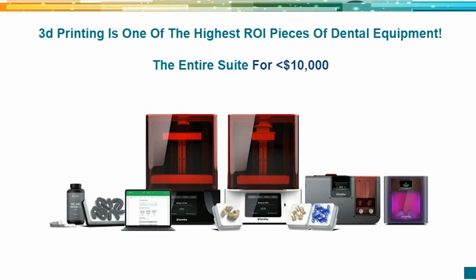So you're going to be looking mostly at that printer on the left, which is the black one, which is the Pro 95. It's your go-to workhorse. It's got a bigger build plate, which you can see kind of under the red glass, is just a larger print area, so you can print more at a time. And it's also maybe not quite as accurate, but you don't need to be more accurate than 95 microns for most applications.